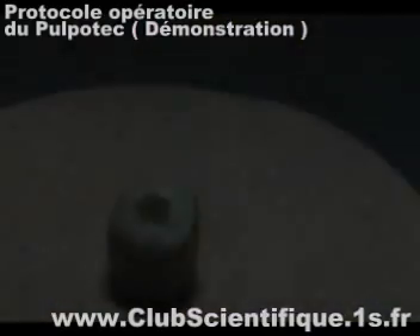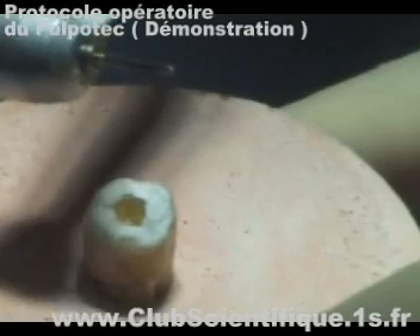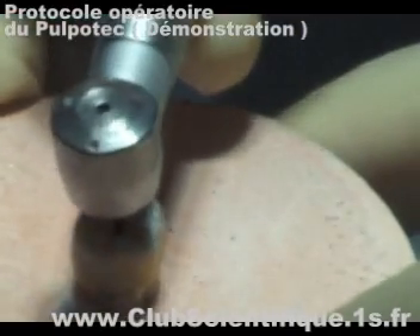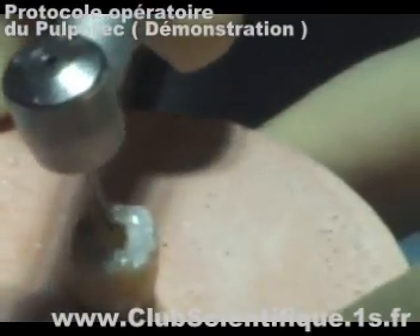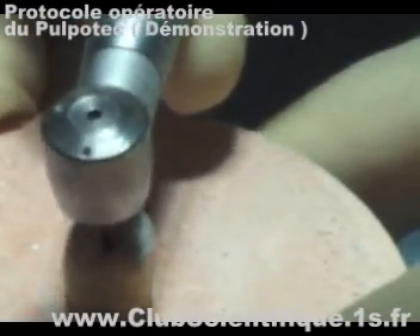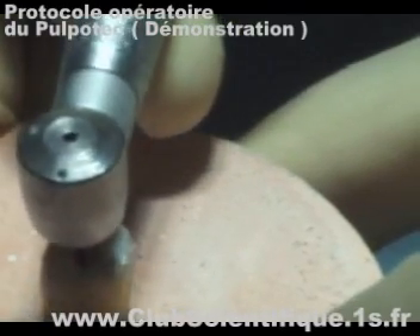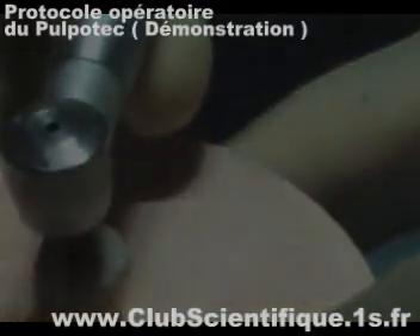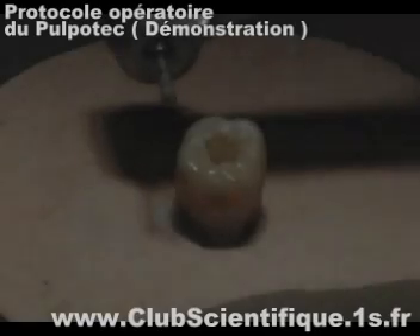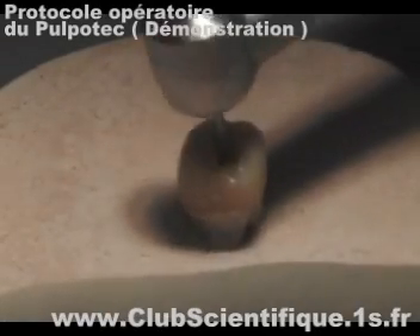Excise the vital pulp from the chamber with a tungsten carbide endo-burr. Shape the pulp chamber with a pier-shaped diamond burr.